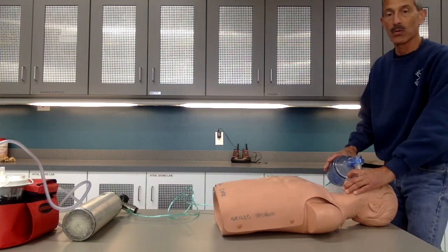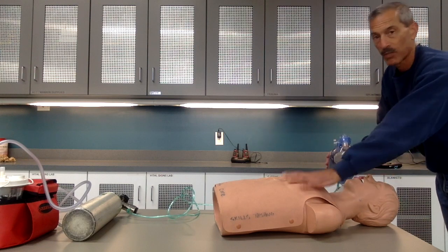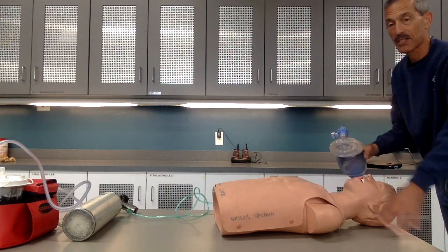The proctor will ask how I know if I'm getting good ventilations and I'm going to say that I have good rise and fall of the chest and my rate is 10 to 12 breaths per minute.